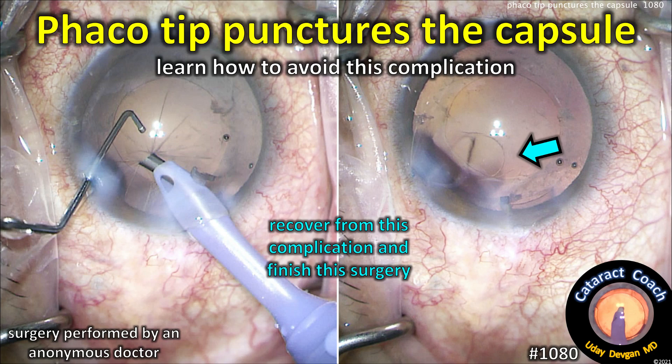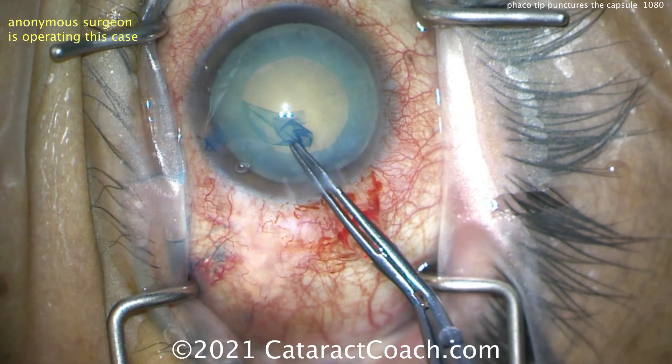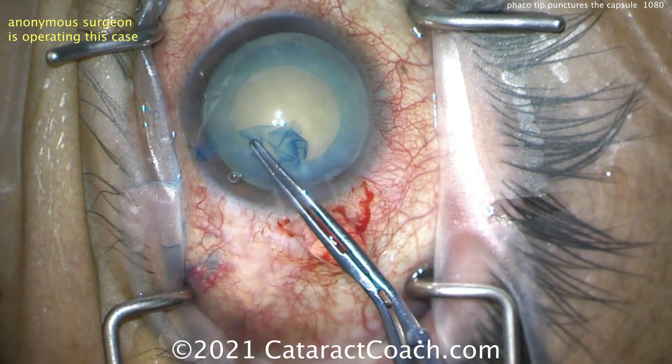cataractcoach.com — the phaco tip punctures the capsule. How do you avoid this complication, and how do you recover from it and finish the surgery? We have an anonymous surgeon who's operating. There's our cataract — a nice white cataract.